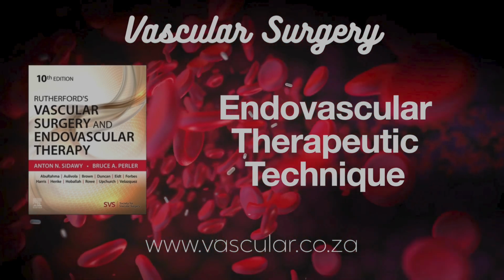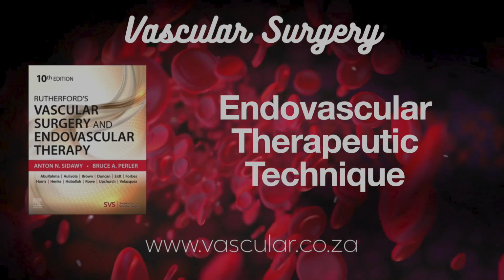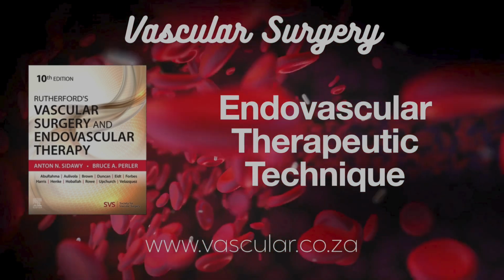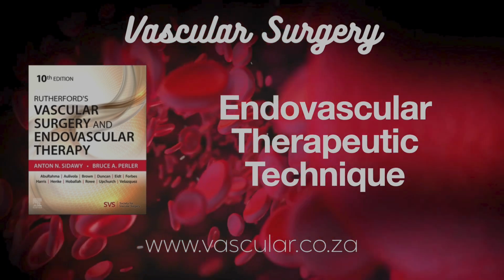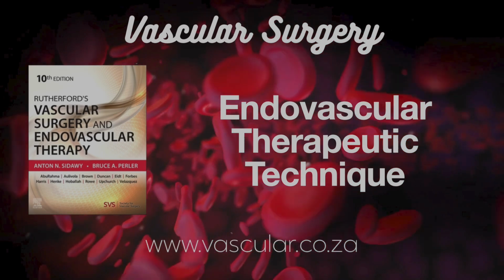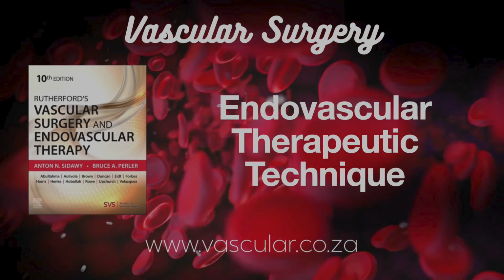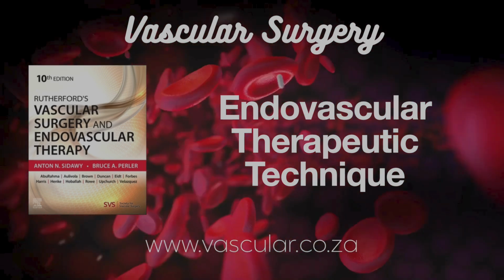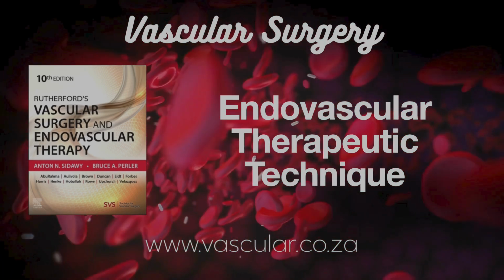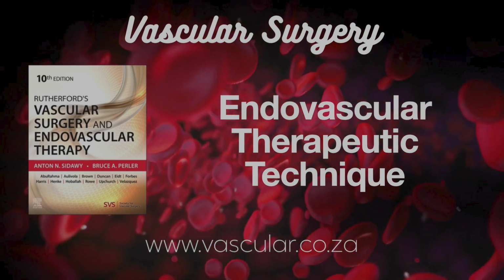Okay. What about scoring balloons? Sounds a bit gentler than cutting. Scoring balloons like the AngioSculpt or Vascutrak are designed to focus the dilating pressure more precisely. AngioSculpt has these fine nitinol wires in a spiral pattern on the surface. And when it inflates, the wires create longitudinal scores on the plaque. There's one-year data showing pretty good patency in calcified SFA popliteal lesions with this. The idea is the scoring creates stress points, channels, leading to more controlled dilation.